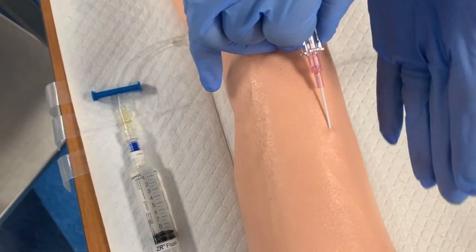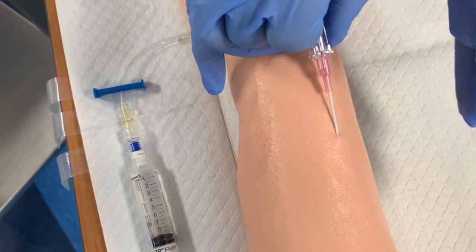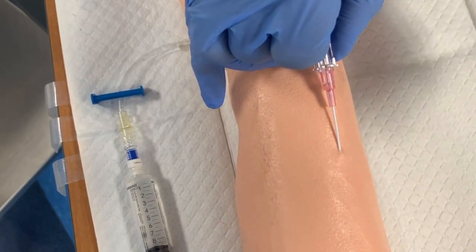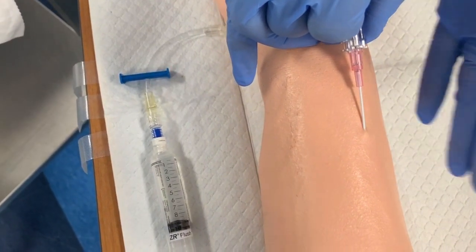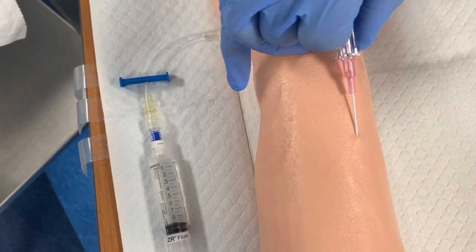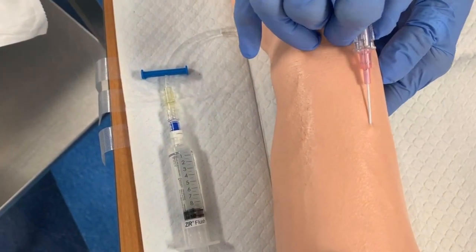And I like to start parallel to the vein of where I'm starting, not on top of it. You will see nurses that do either way, but as a new IV starter, I often think it's great to start just parallel to where you want to stick so you won't go through both the top and bottom walls of the vein and infiltrate your IV.